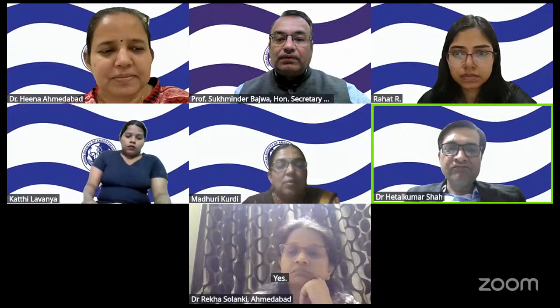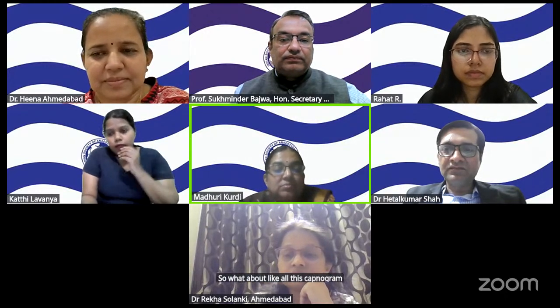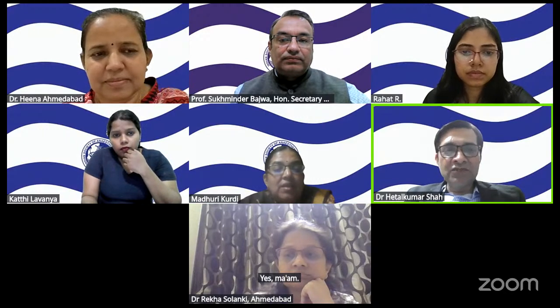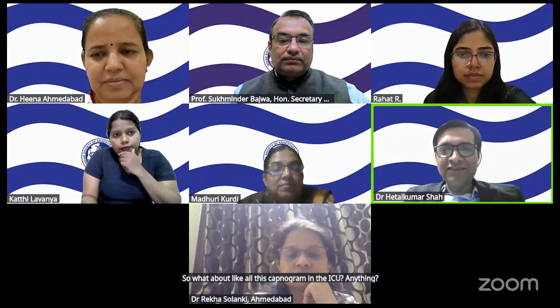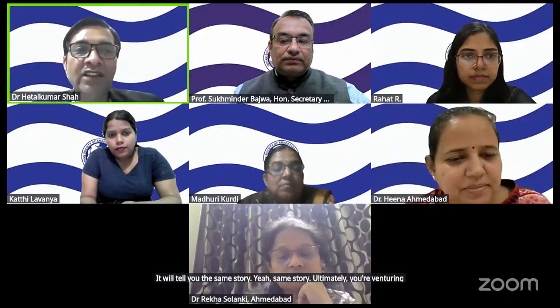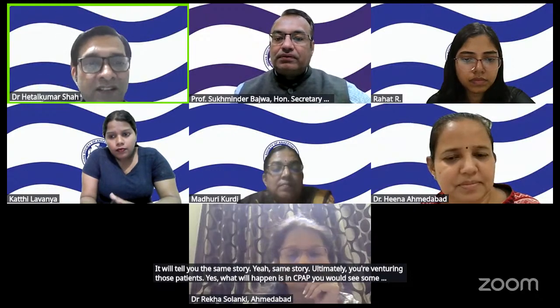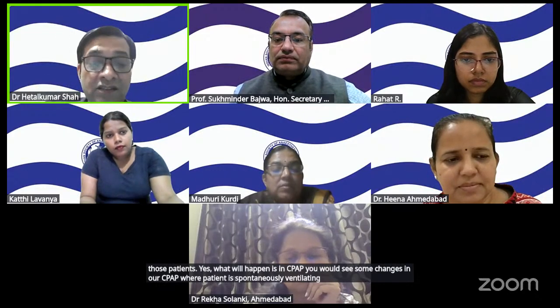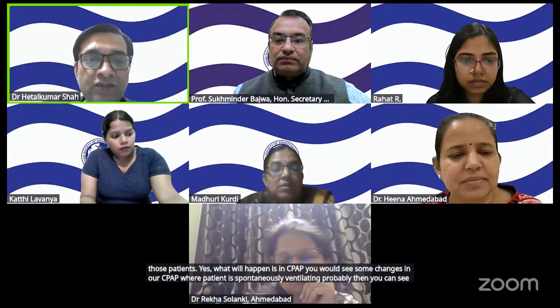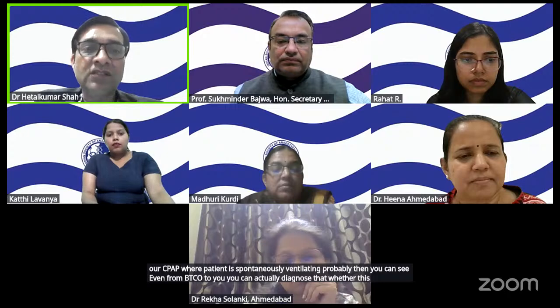So what about all these capnograms in the ICU? It will tell you the same story. Ultimately, you're ventilating those patients. In CPAP, where the patient is spontaneously ventilating, you would see some changes. From EtCO2 in the ICU, you can actually diagnose whether this patient is ready for extubation or not.